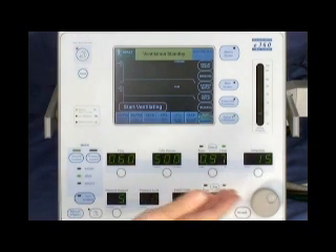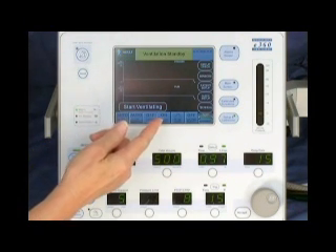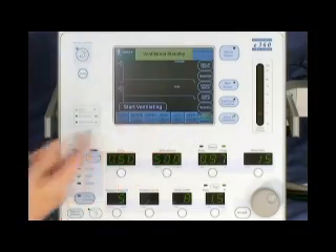The primary ventilation controls are on the lower half of the front panel. On the left side, you'll find the selectors for two of the breath types — volume and pressure control — as well as the indicators for assist control, SIMV, and SPONT modes of ventilation. Controls for activating the other two breath types are found in the advanced dataset on the graphical user interface.